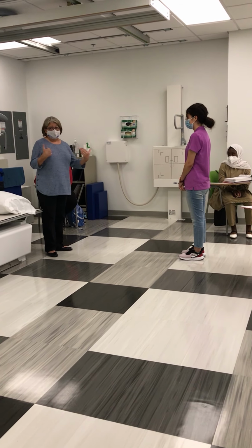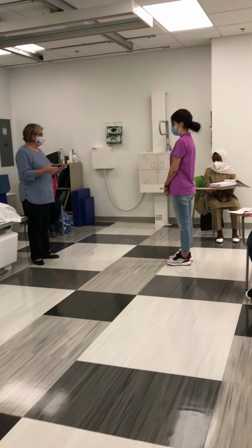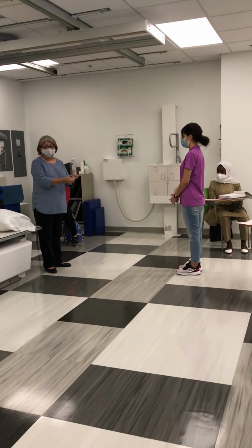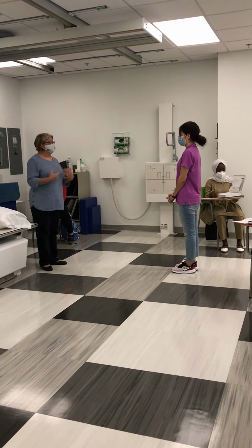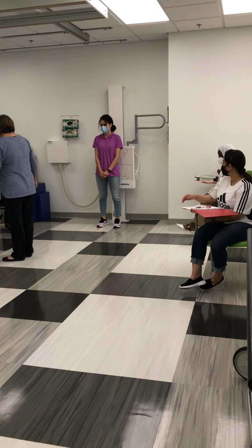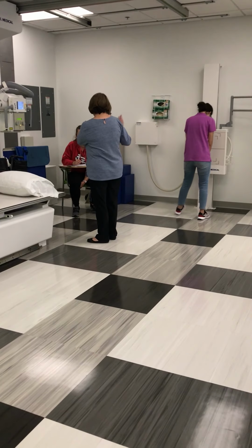So again, this is what you'll go through with your patient for your simulation. You introduce yourself, you ask for the patient's full name, date of birth, and if you have a female patient, you ask if there's any chance they could be pregnant. I'm going to start out demonstrating the PA and lateral chest. Those are 2 projections, 1 exam.